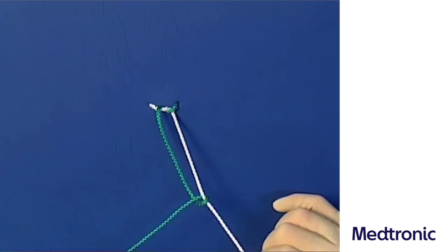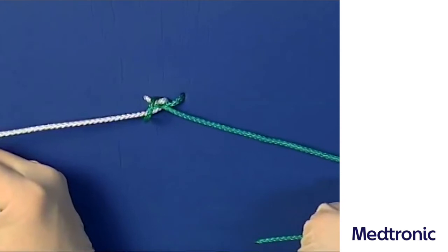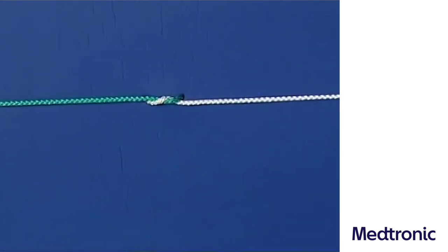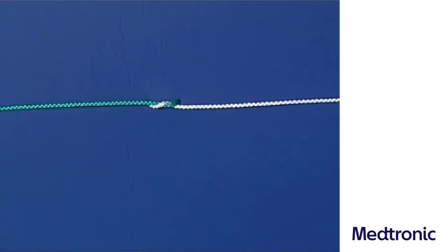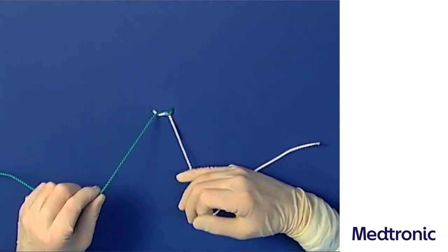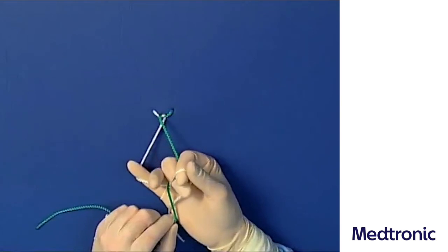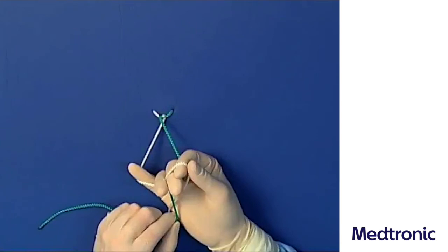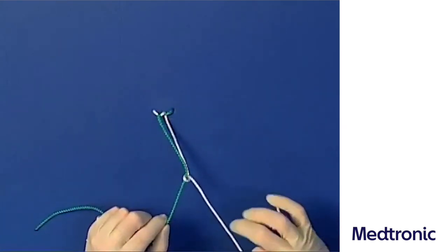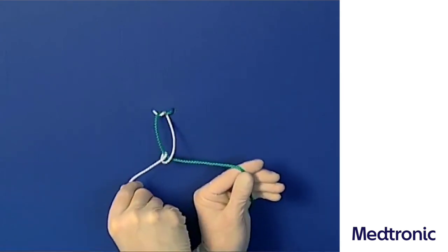For the granny knot, the second loop is made in the same form as the first. Again, the left suture end is held between the right thumb and index finger and led around the ulnar margin of the fifth finger of the right hand. The pulling and tying threads are crossed so that the tying thread can be clamped between the right middle and ring fingers. Using these two fingers, the tying thread is now pulled through the produced loop. In order to lay the knot flat, the hands have to be crossed anti-clockwise by 180 degrees, then the loop can be pulled tight.